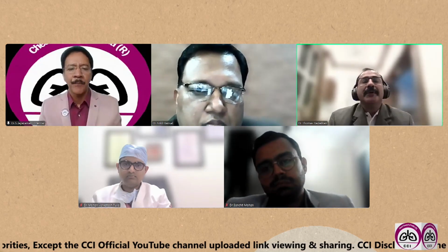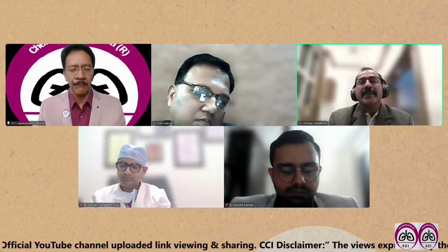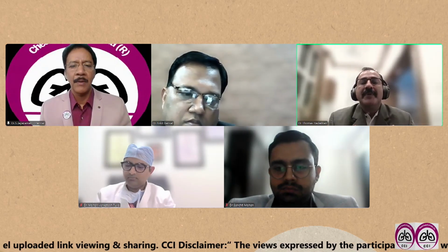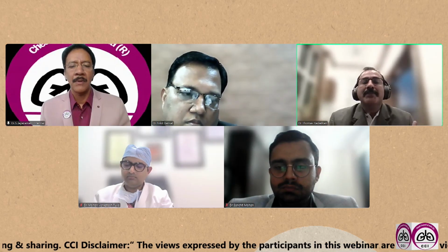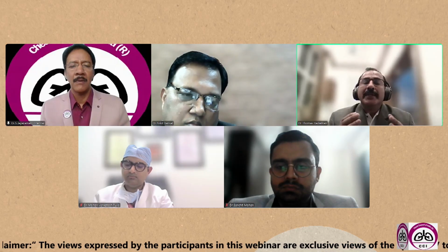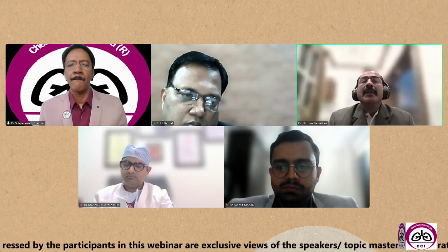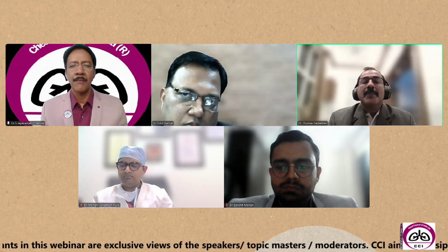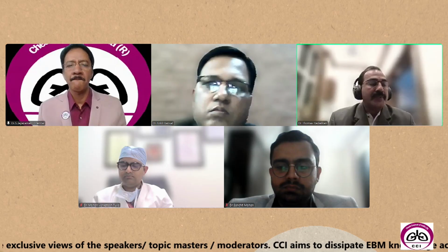The one limitation of EBUS scopy was less tissue, or tissue is the issue. In that case, in between the mediastinoscopy and the conventional EBUS, intranodal forceps biopsy or cryobiopsy can be used to get maximum tissue from the node. This is particularly useful in cases of granulomatous disease or lymphoma, where lymph node architecture is more important. And if you want to get more tissue, like in the current era of NGS and targeted therapy, you need more tissue so that you can use either intranodal cryo or forceps biopsy.